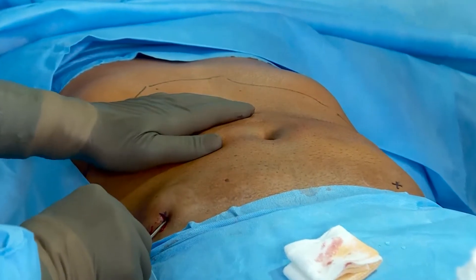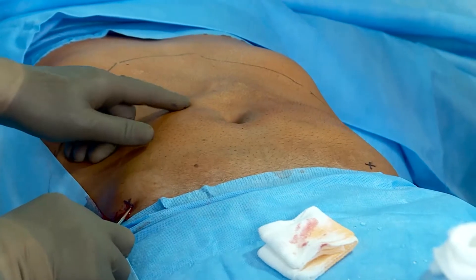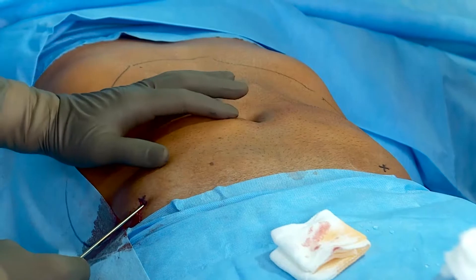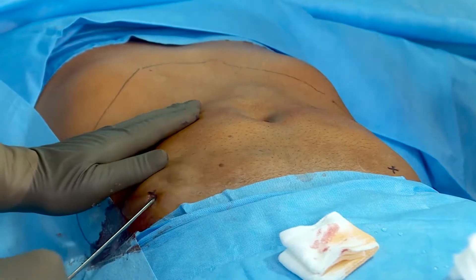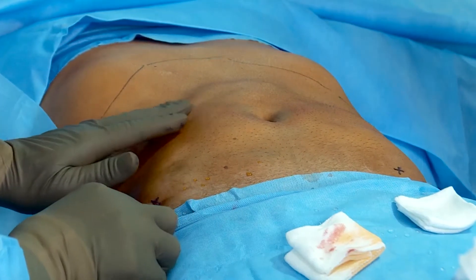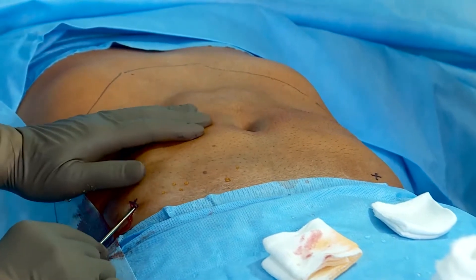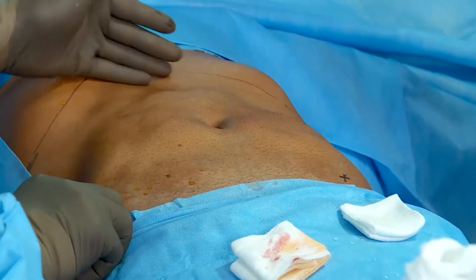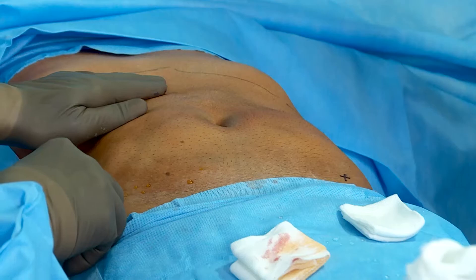We changed the direction of the cannula — you will be able to appreciate the fluid getting accumulated underneath the skin. We have to be very careful near the umbilicus. As part of preoperative profile, we always get an ultrasound of the abdomen done in all patients to check for any occult hernia or abnormality in the anterior abdominal wall. I have marked the line beyond which I would not like to go, because going too close to the diaphragm and the costal line gets painful for the patient.